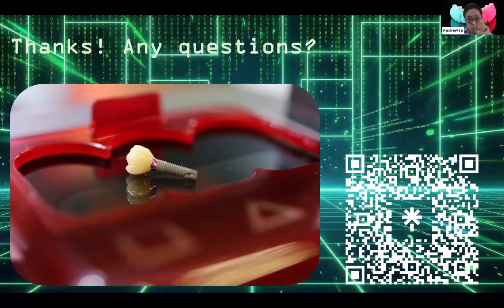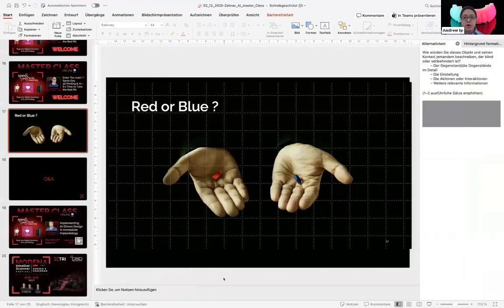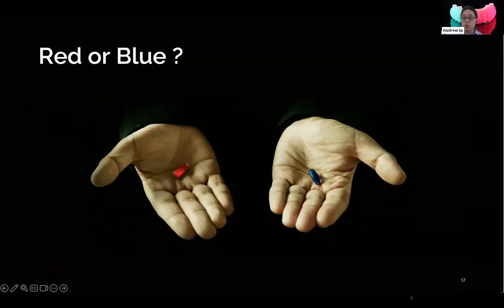I know the angulated screw, the 2.6 millimeter screw for Tri, is actually preloaded onto the AI Crown software. I haven't honestly tested that out, to be frank, because in the grand majority of my cases, maybe I'm lucky, I have straight access. But I know for sure that the angulated screw for Tri is preloaded onto their library essentially. So whether or not you can actually manually change that angulation, I'm not sure yet.